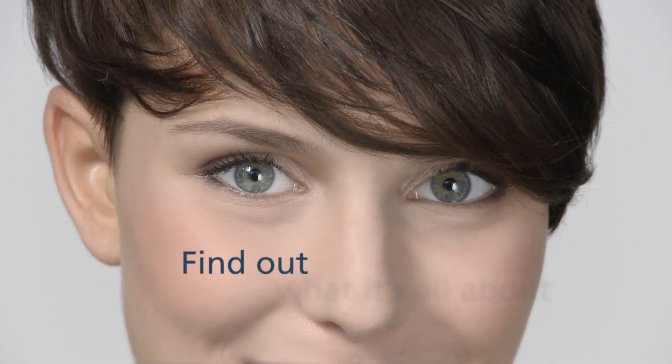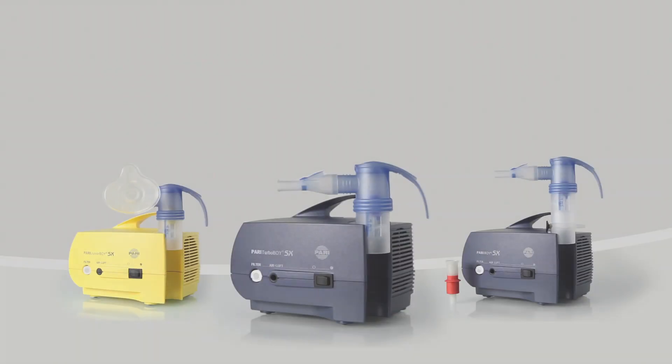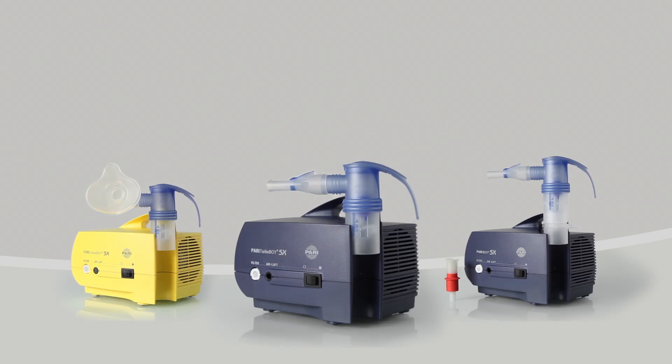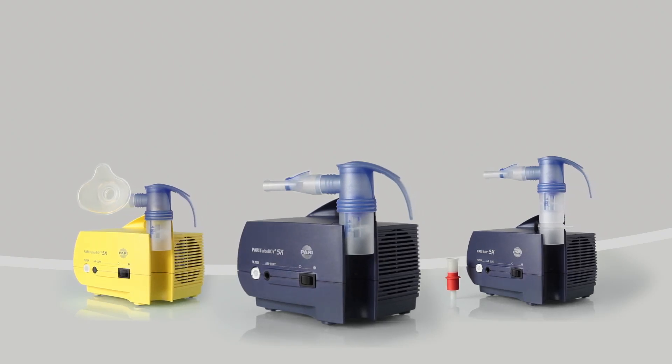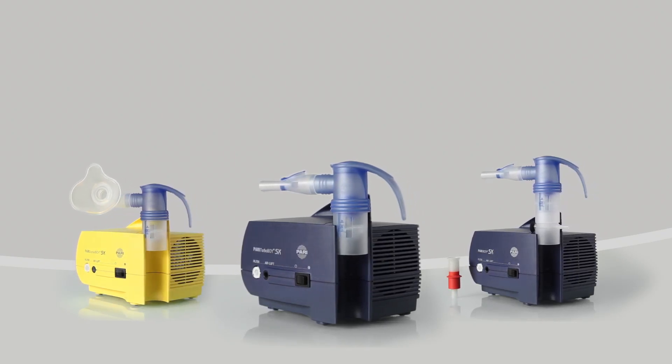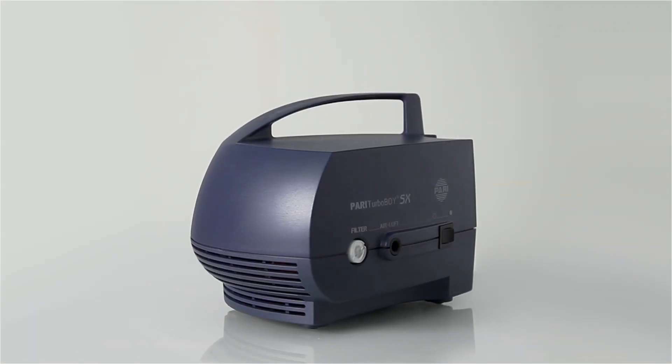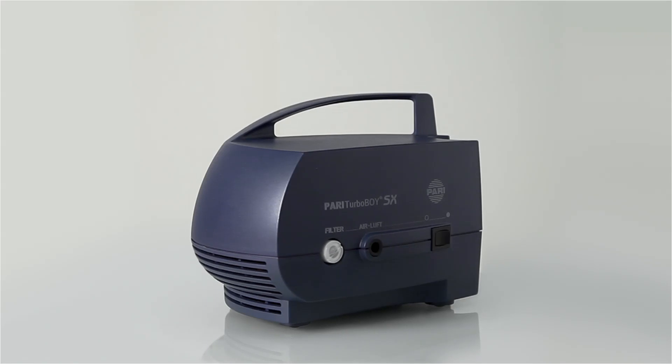Find out what it's all about. Get to know the Pari Turbo Boy SX — one of three inhalation devices your doctor has chosen for you from the new Pari Boy SX family. It's easy to operate, works quickly, and can be used by everyone over the age of four. A real all-rounder.